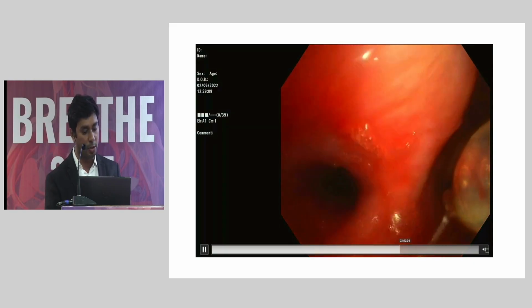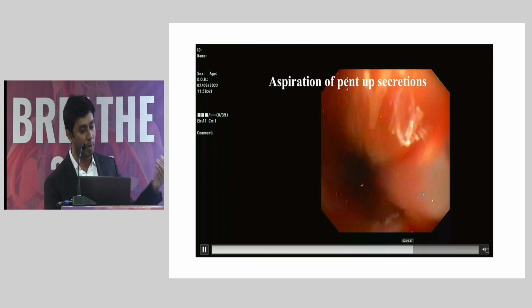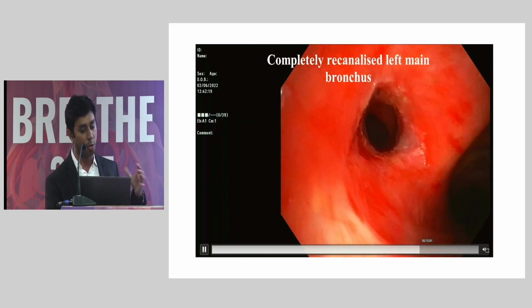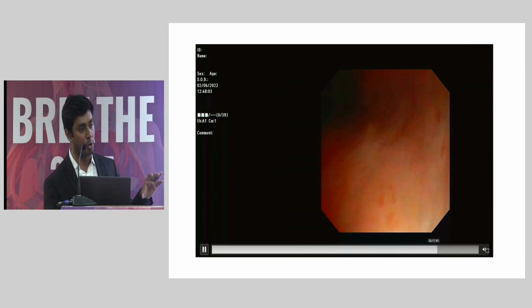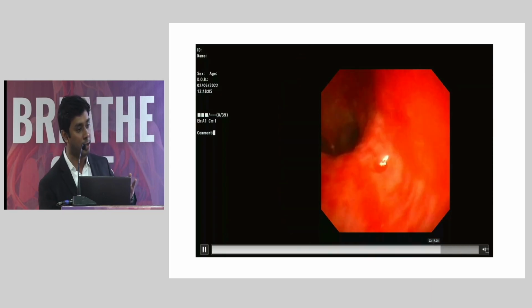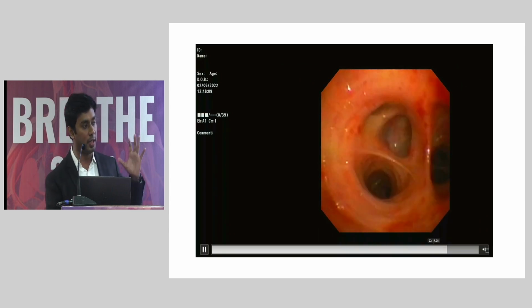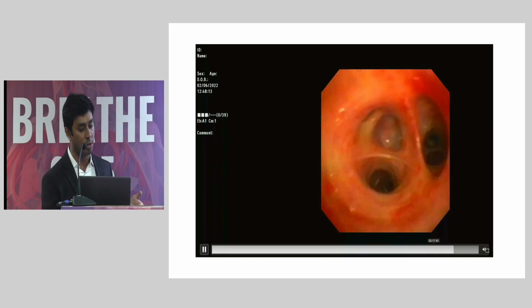And once the CRE balloon is inflated, now you can see that a lot of pent up pus and mucus secretion which was there in the distal segment is retracted, and now you can see that the airway is completely open, and we are even able to pass our bronchoscope, and we are even able to define all the subsegments in the distal plane. So we thought that the lung may not expand because the surfactant would have gone, because the collapse was there for almost around 6 months.